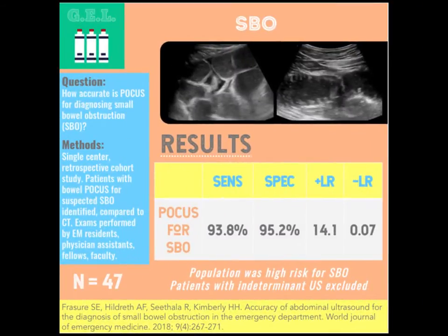So we actually looked at this a couple of years ago, and we wanted to know how accurate a point-of-care ultrasound would be for diagnosing small bowel obstructions in patients who also underwent CT imaging as the gold standard. We wanted to see if there was any difference in level of provider training, so whether you were an intern or a senior resident, a physician's assistant, an ultrasound fellow, or an ultrasound attending.